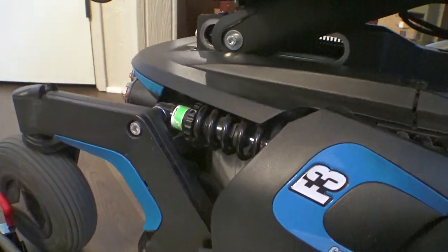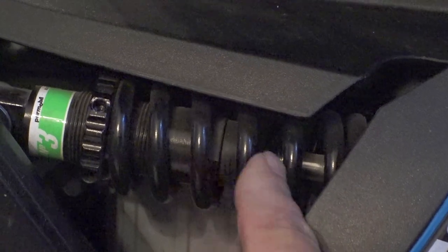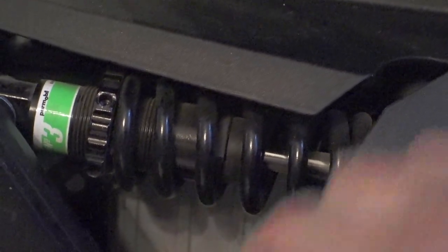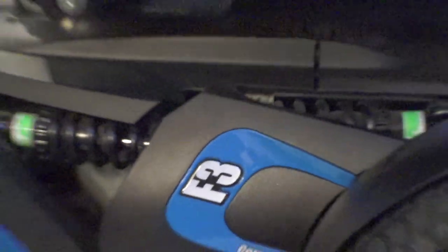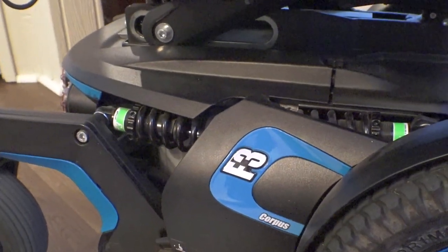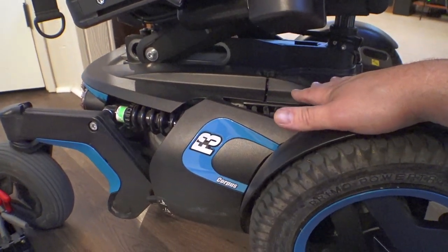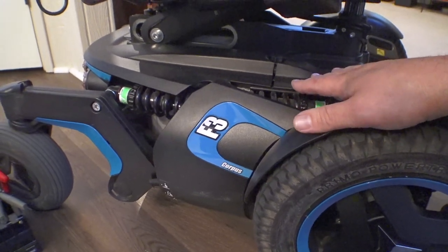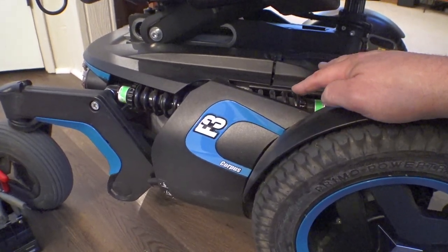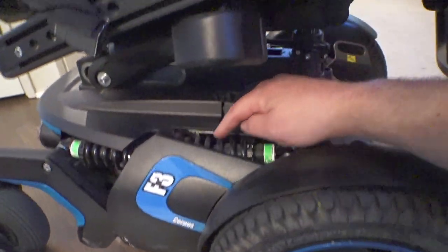When I got this chair there were little rubber caps that go over these shock absorbers and they were not attached, so I had to push those back with a screwdriver and get them latched into place. I don't know if dirt or something got in there, but I occasionally use a little bit of silicone lube on these shock absorber shafts. I don't really recommend putting chemicals on those because that can affect the seals, but that's just what I wound up doing.